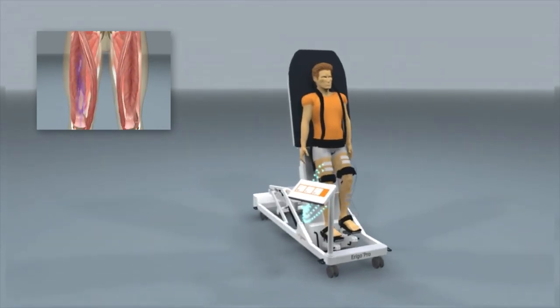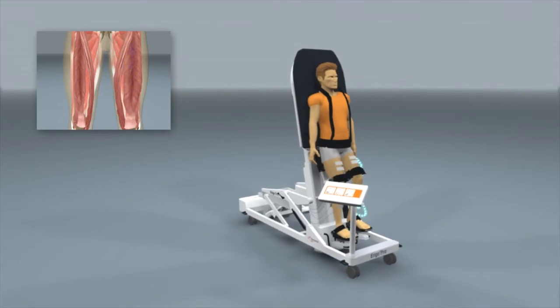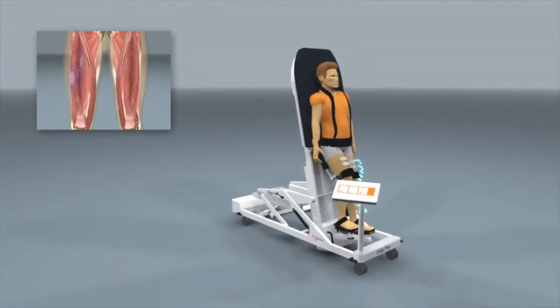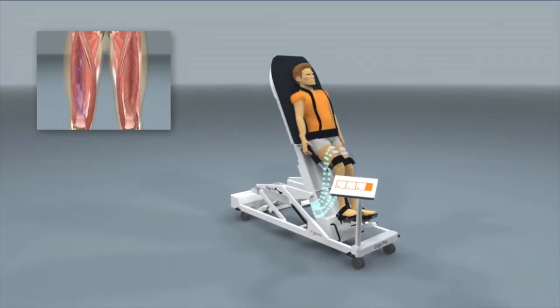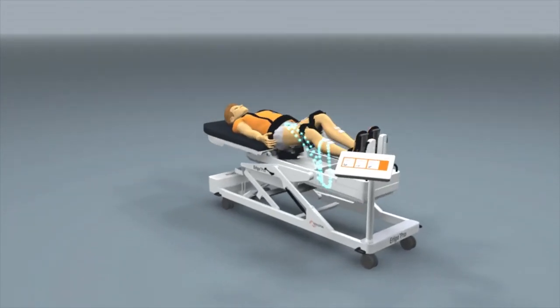Hocoma's Erigo offers therapists a safe solution for early mobilization. It improves patients' recovery and can reduce time in acute care.